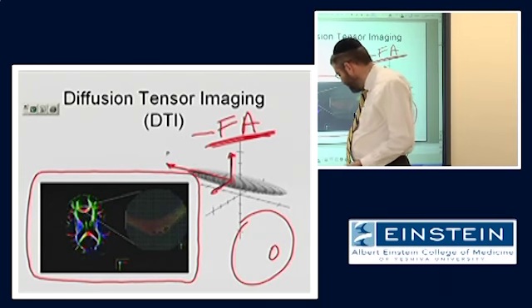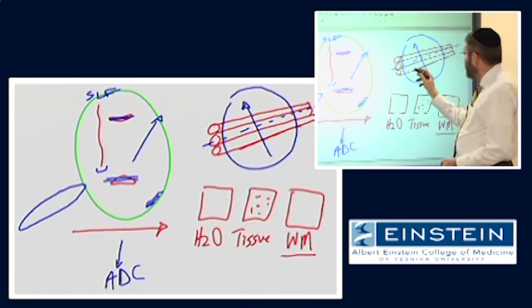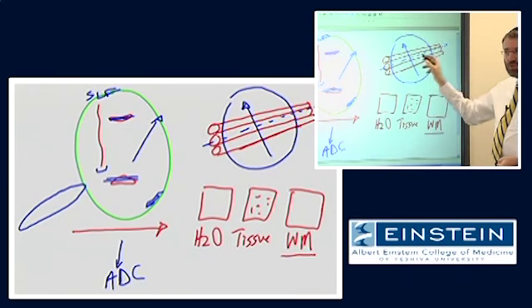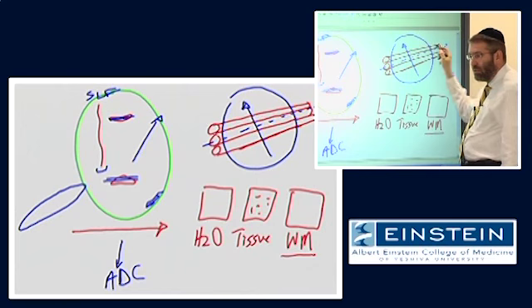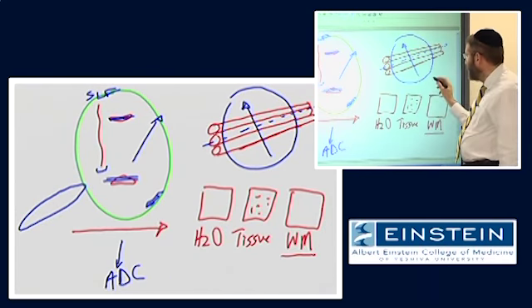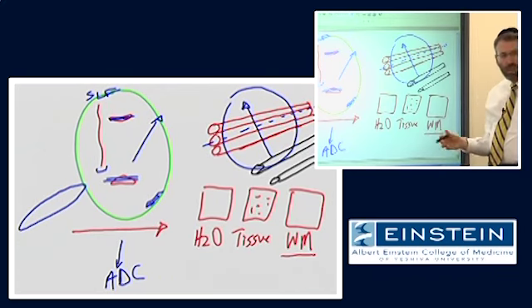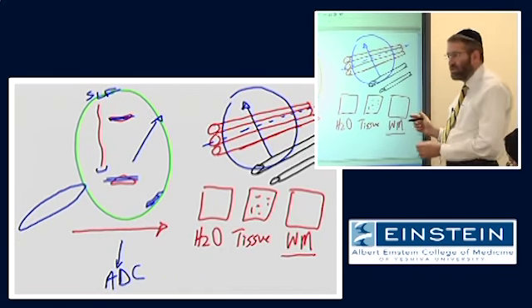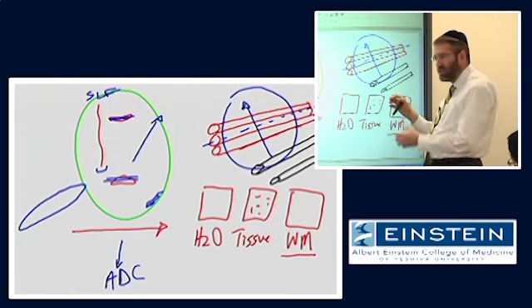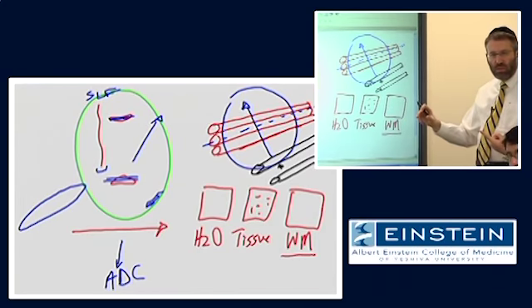When we looked at our diagram here, the reason that diffusion dominated along the long axis of this fiber was because of all of that linearly oriented structure, including myelin. In the absence of myelin, we can have a situation where these axons are spaced apart. The myelin is gone. This is just one potential scenario. All of this space is areas where there may be diffusion that defies this linear orientation.